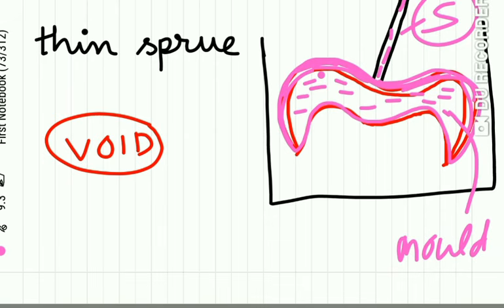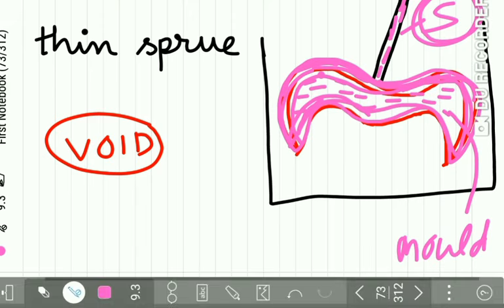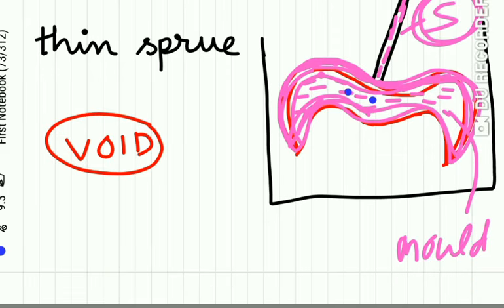As the metal cools down, this layer of solidified alloy on the periphery increases, but the core is still soft. Now in this case, if the sprue used is very thin, the metal present inside the sprue itself undergoes solidification, while the bulkier space is still partially molten. This is the core which is still molten. Now, as time elapses, this core also undergoes solidification.